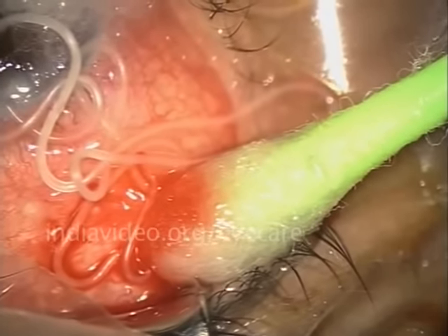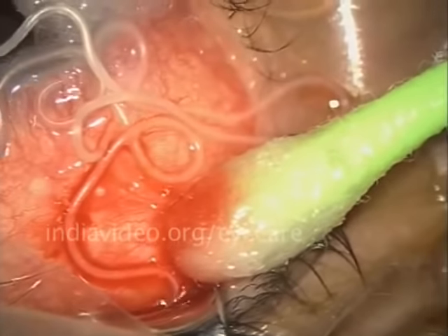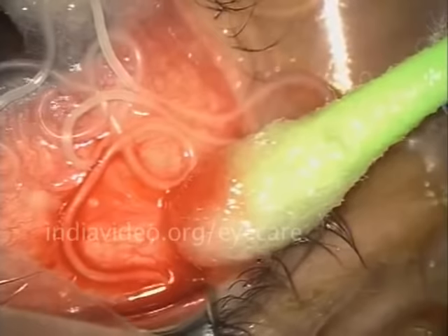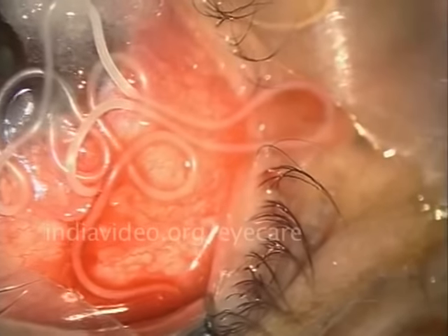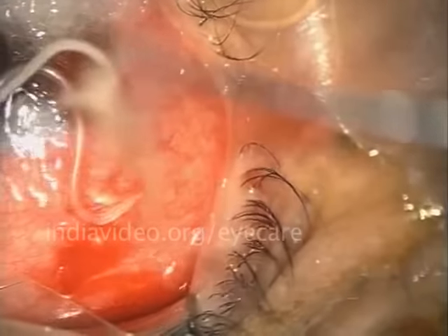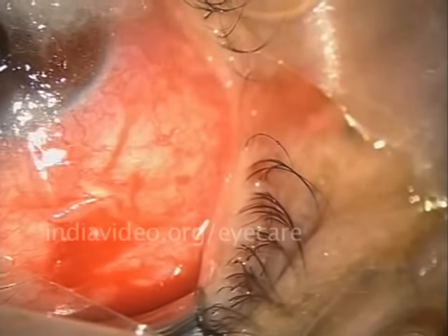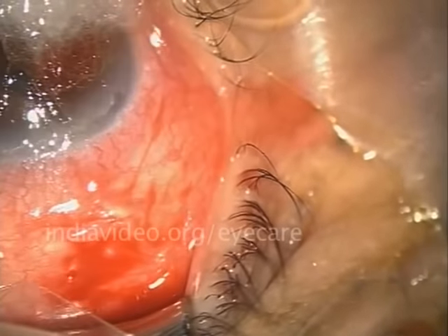It has wriggled free from the eye and I can see both the ends. This is the time I know that it is not going to go anywhere else. It is going to be here and I have all the time in the world to take it out. I can be reasonably sure that no part of the worm is now going to remain inside the patient's eye.